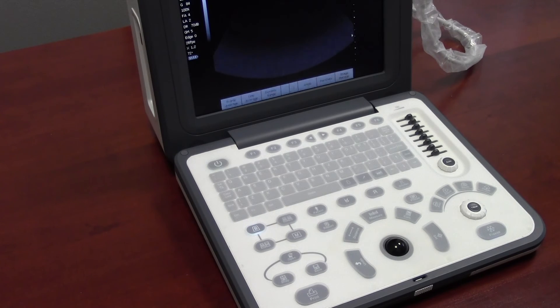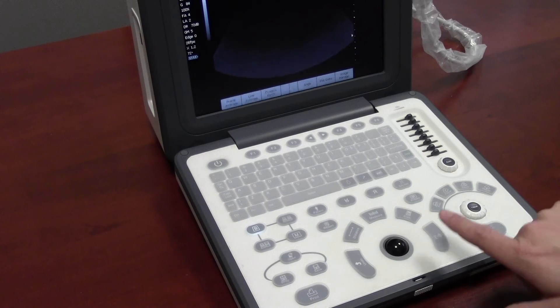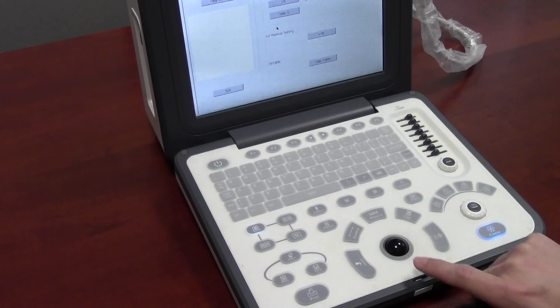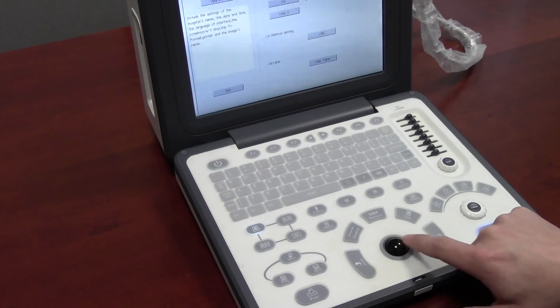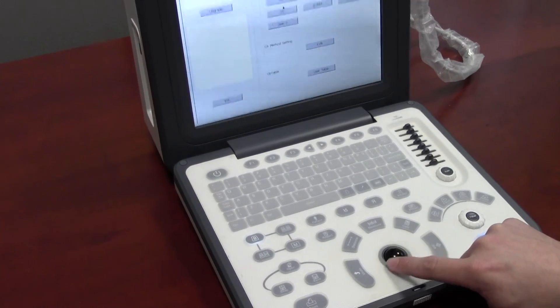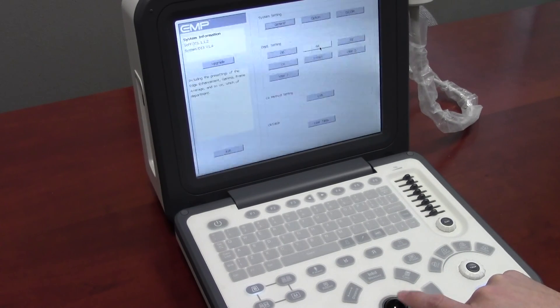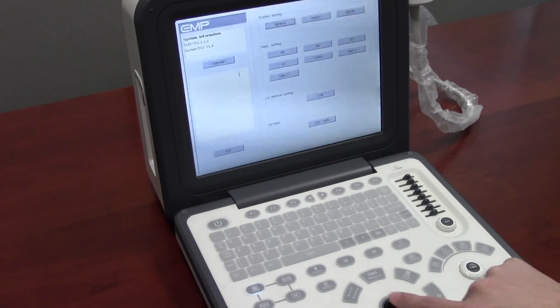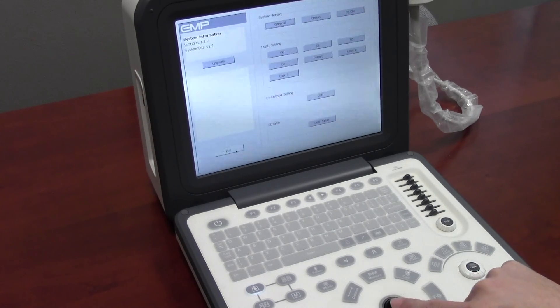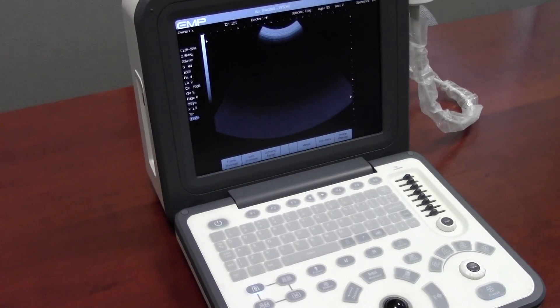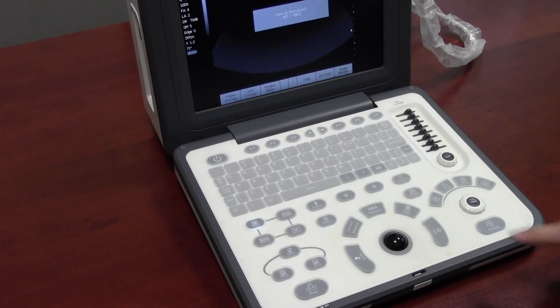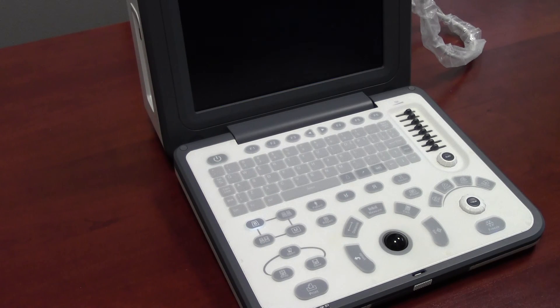Once you are finished with your study, you can go back and review it and make changes as necessary. Use the preset key to change system parameters such as date and time, measurement tools, and set up DICOM. You can also make adjustments to individual presets such as OB and abdomen. In the left-hand corner, you will see that it also displays some system information. Once you are all finished, press the power button in the left-hand corner, press set, and wait for the machine to turn off.